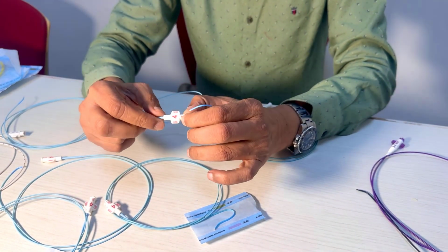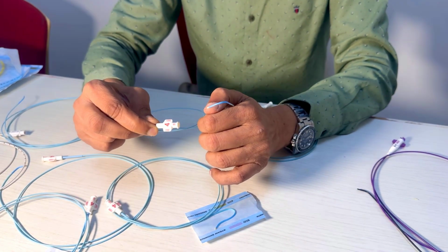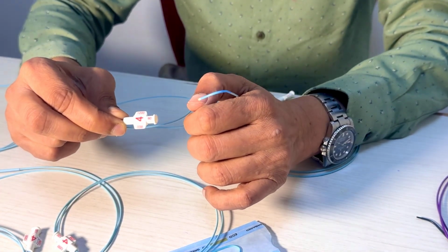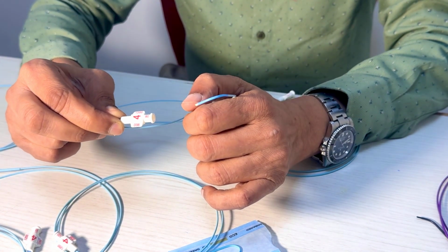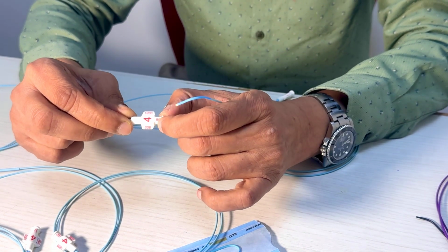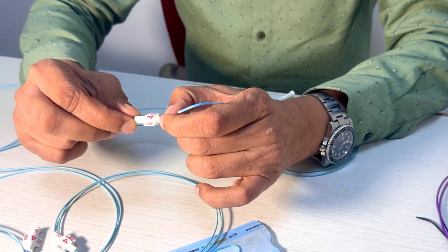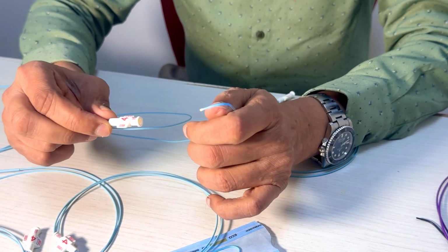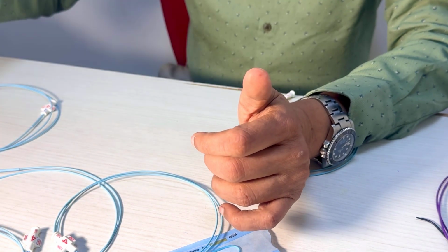On an 80 centimeter catheter, you cannot use even a 70 centimeter sheath. The problem is you'll have only 10 centimeters outside, and sometimes that becomes challenging. Worse still, if on an 80 centimeter catheter you put a 90 or 100 centimeter sheath, the catheter won't exit out. You understand? This challenge can be very common.